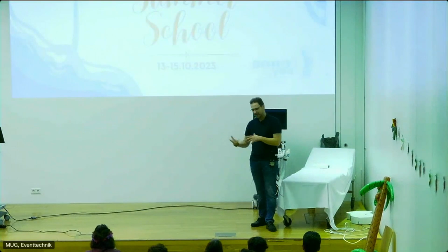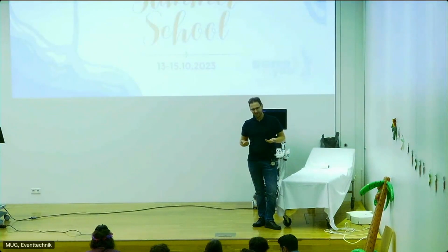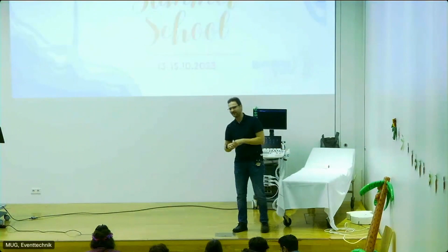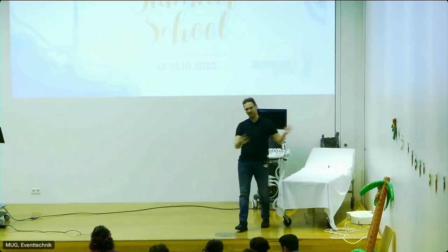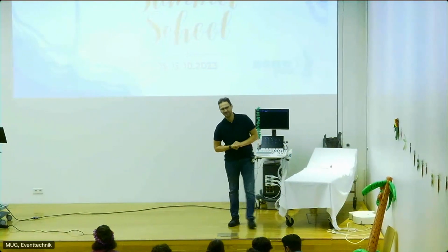In our resuscitation area, usually we remove the vacuum mattress and the patient goes on another table, and we do the CT scan also without the vacuum mattress. So the patient enters, we put him on our table, we make the eFAST exam, and then we decide what to do next, if we need to go to CT or OR. Okay, thank you very much.